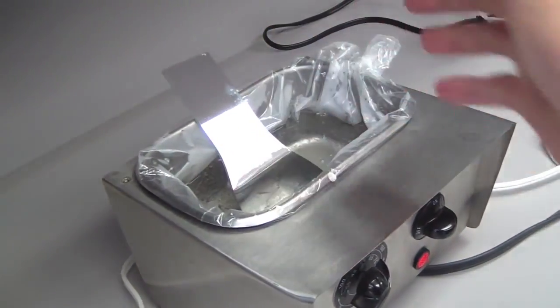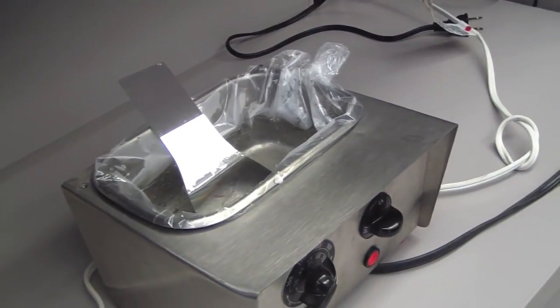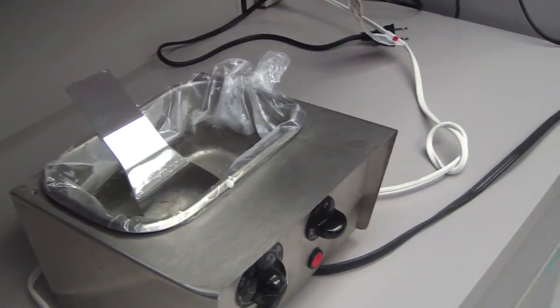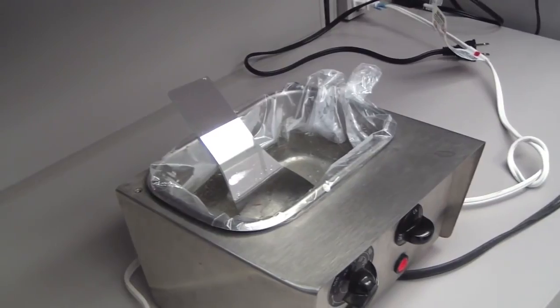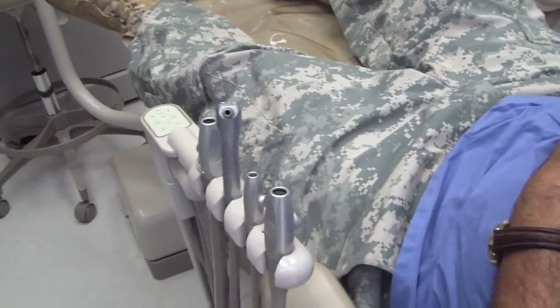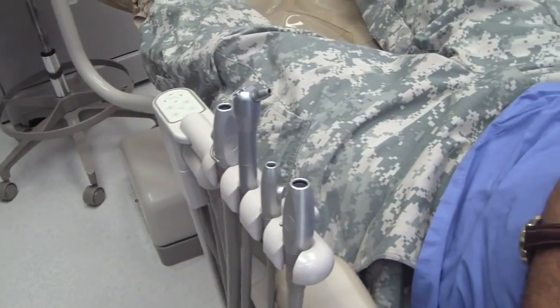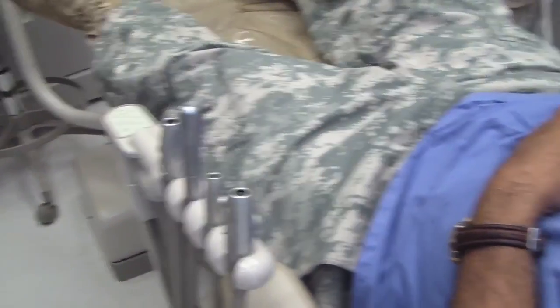You can see it's just warming up there. So you can take a number of intraoral photos without having fog. You'll notice I've seen enough journal articles now, literature articles, to see that the mirrors are fogged. Additionally, you can have your dental assistant or someone blow air on the mirror. That also helps if you don't have the water bath out.